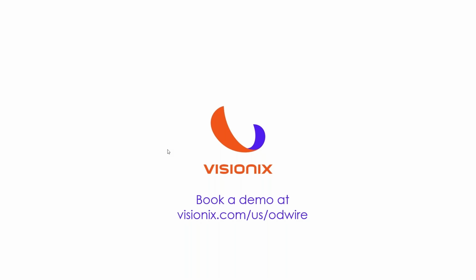Now, peripheral retinal disease is a different story. If you're suspecting a patient has peripheral retinal disease, peripheral retinal ischemia, that's a patient I'm going to refer out. I'm not going to sit and try to piece together images. What I want to see is more than enough with the 12 by 12.